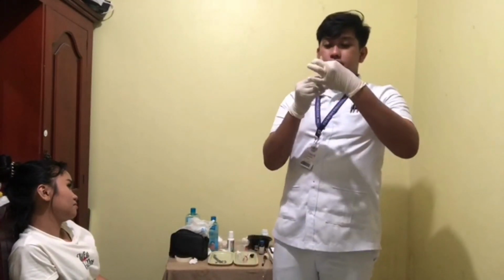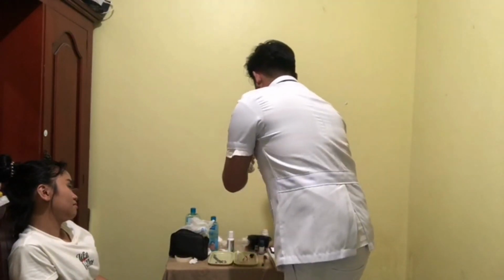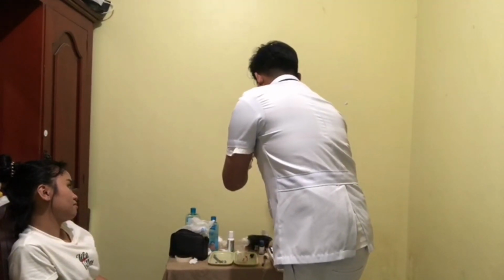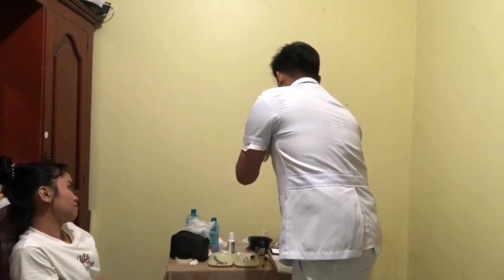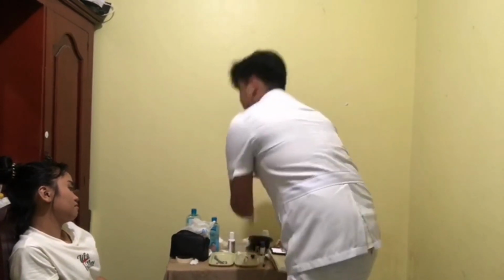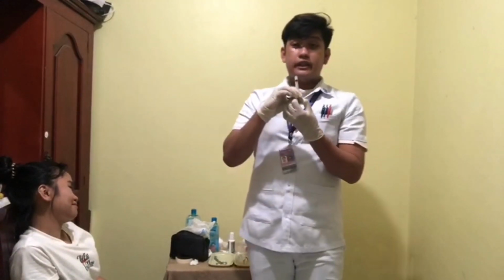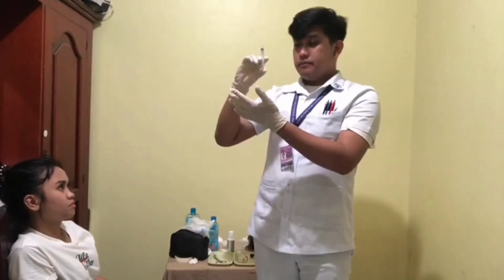This one is removed, and after that I am going to discard the cap. Then hold the syringe between the thumb and forefinger of your dominant hand, which is my right hand, holding it like a dart, like this.